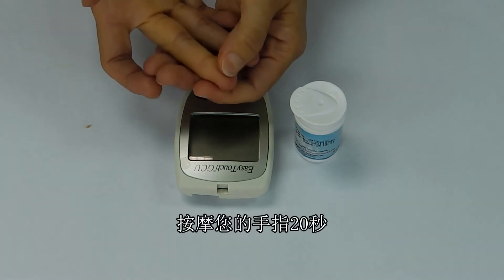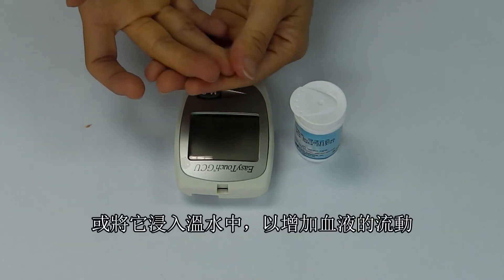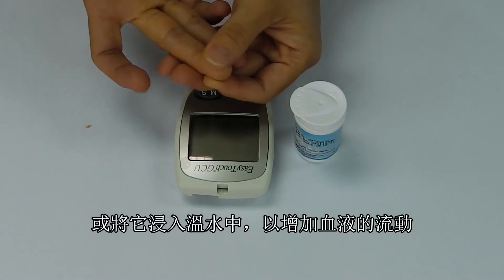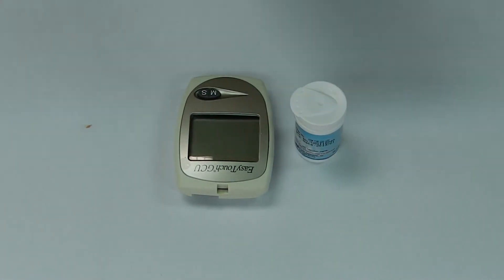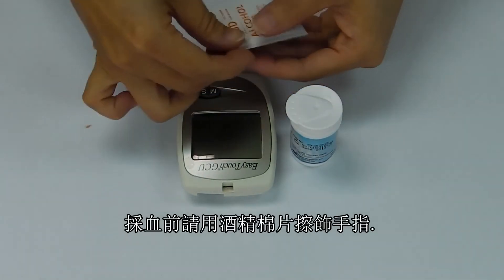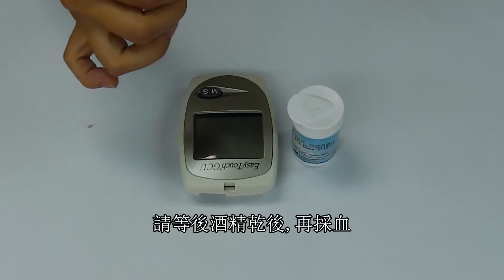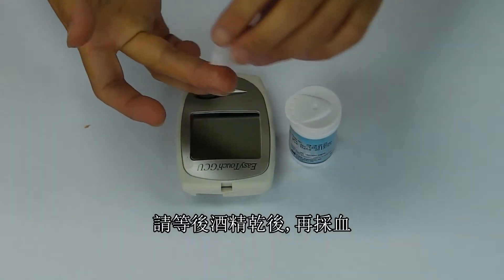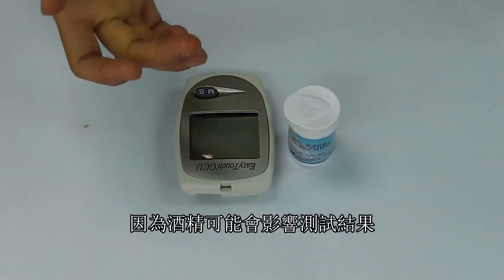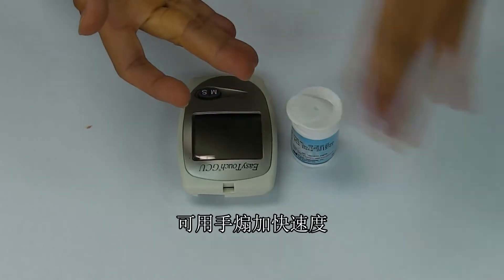Massage the lancing area for 20 seconds or immerse it in warm water to increase blood flow and ensure a more representative sample. Sterilize your finger with an alcohol swab. Be sure that the lancing site is completely dry before testing, as any remaining alcohol may influence the test. Fan dry the lancing site to speed up the drying process.